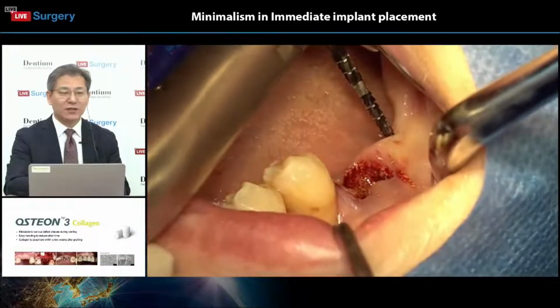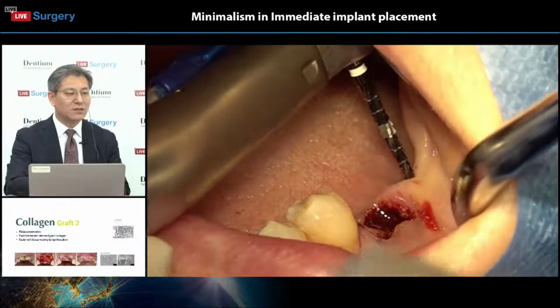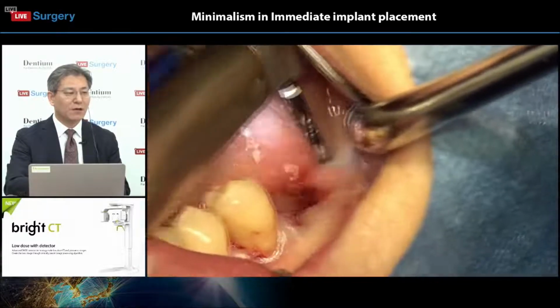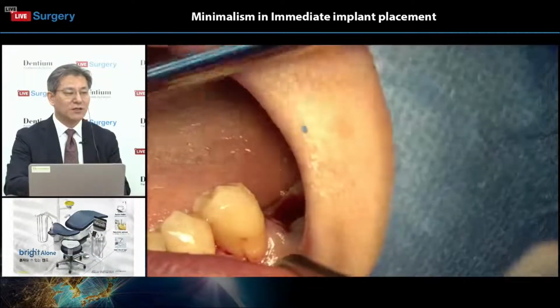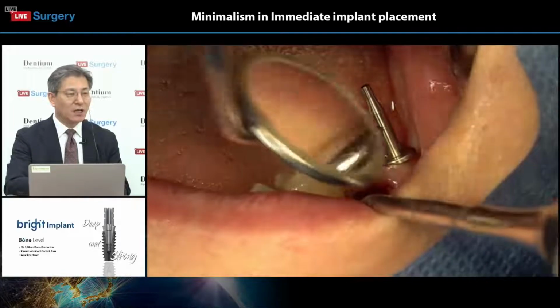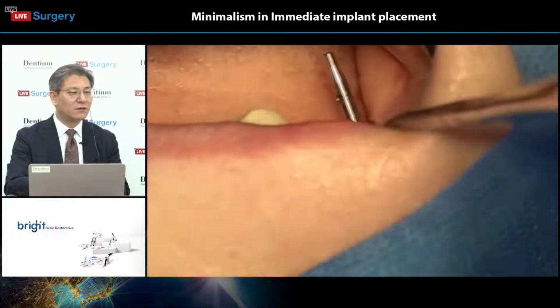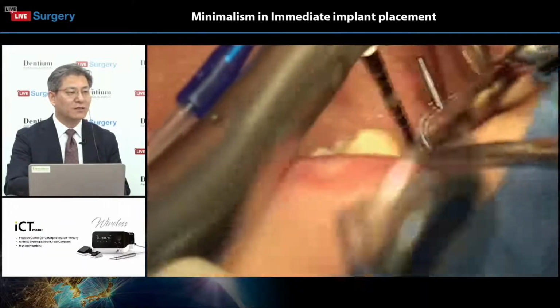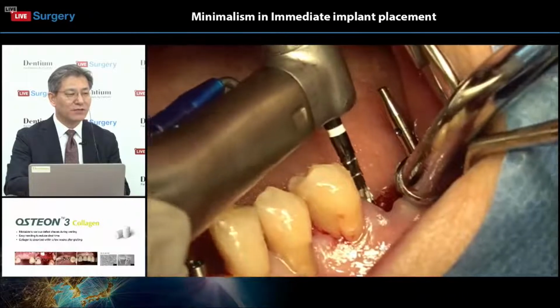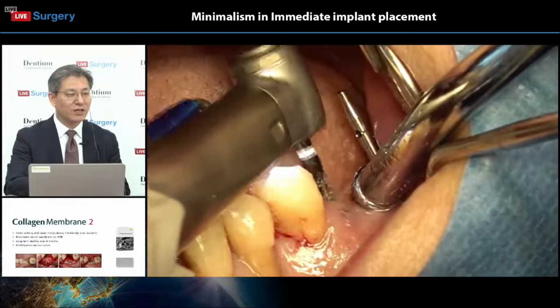Okay, during the conditioning, he will do another implant, number 37 area. He is now going to try flapless drilling. Actually, a 9 millimeter implant fixture will be installed. Okay, checking the path. After that, now he is going to do number 36 socket implantation, immediate implant surgery. This is osteotomy drilling here.